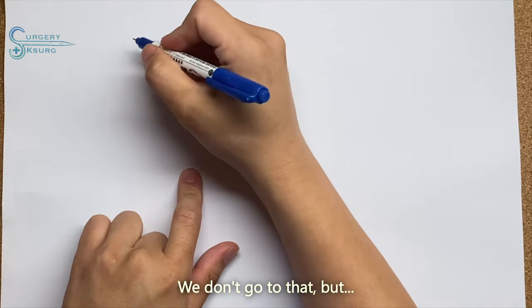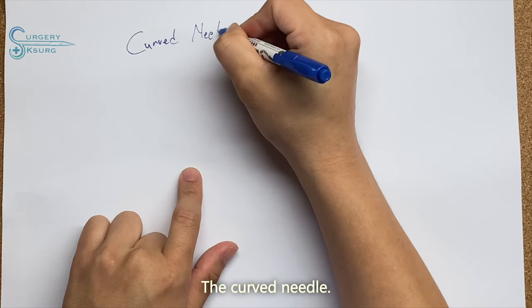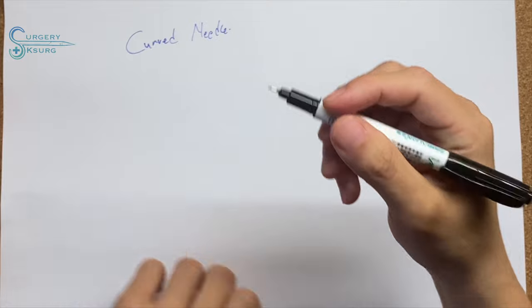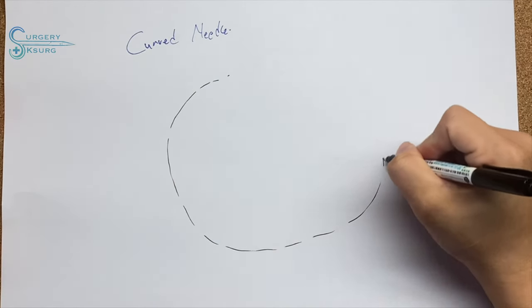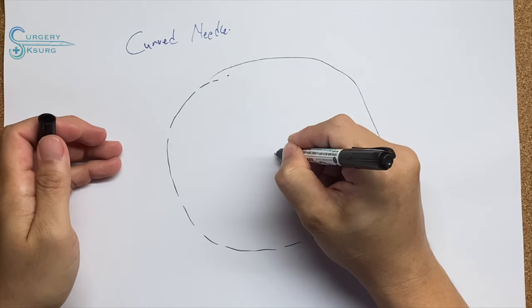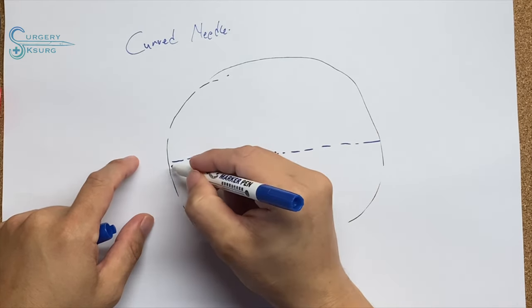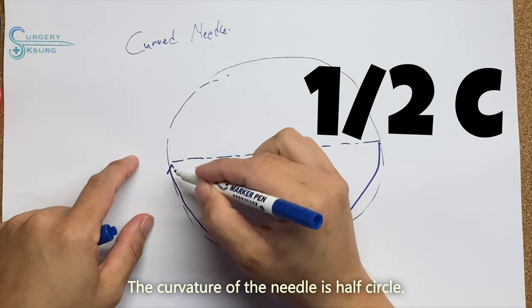But how about the curved needle? How are we going to classify the curvature of the needle? It's actually very easy. You just take a look. This is a circle. Sorry, my circle is not so well done. This is the center of the circle. Is the curve a half circle? That means the needle is like this. The curvature of the needle is a half circle.